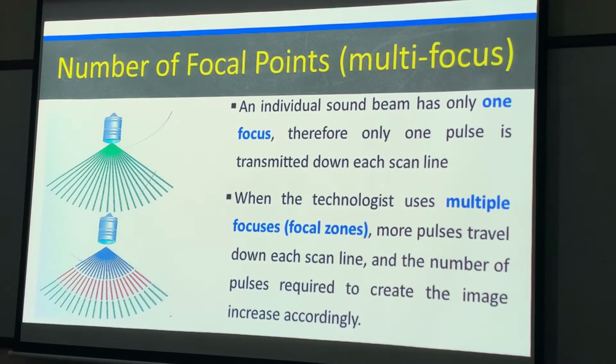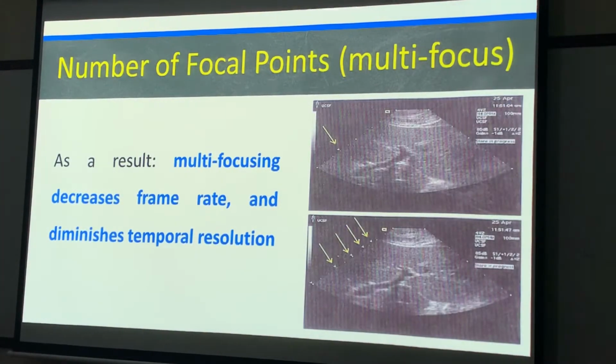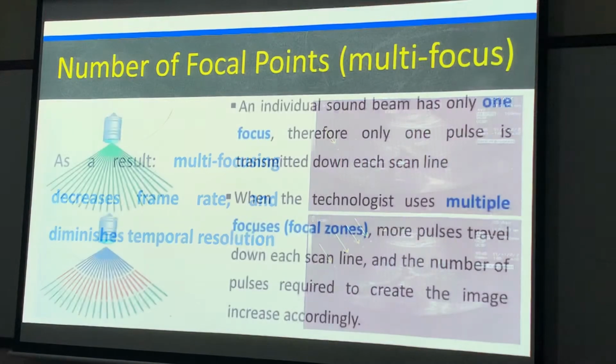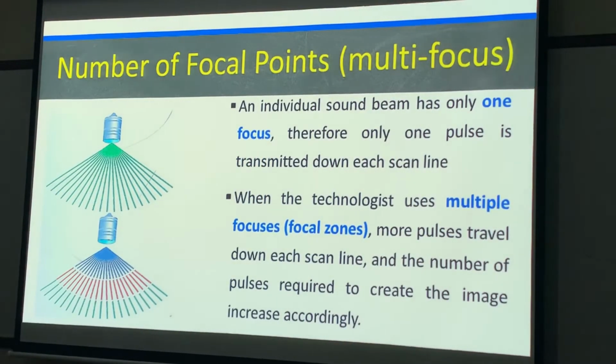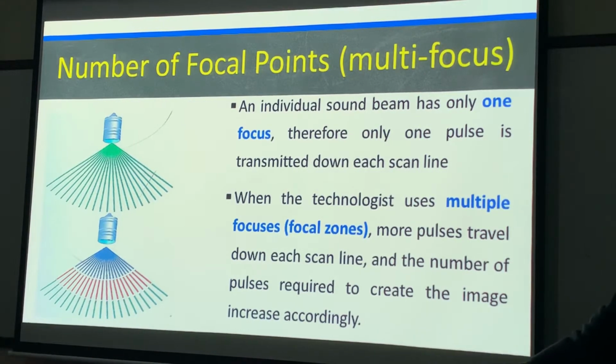Questions? So with the multi-focus zone, the frame rate is going to decrease? It's going to decrease. Okay, got it. Remember, our three things all fall under number of pulses. So it's going to decrease.